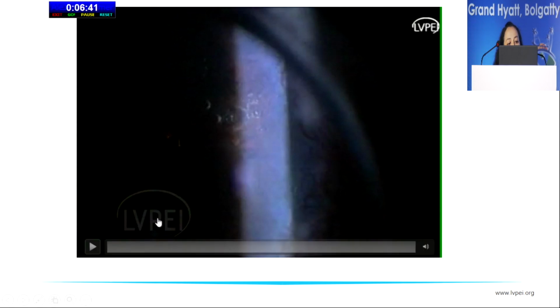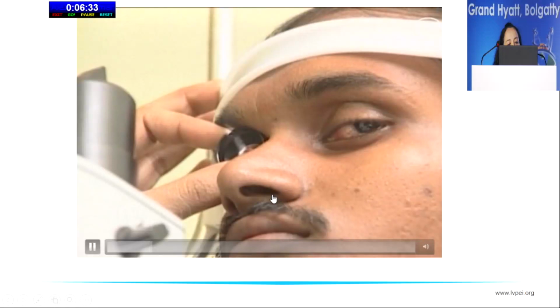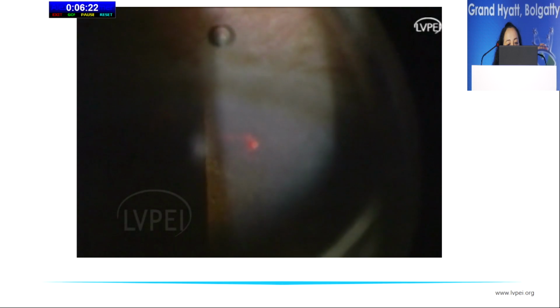In this small video, we'll just show the gush of fluid which happens. Identify a thin region in the depth of a crypt or in an area evidenced by a rather lacy, transilluminated appearance. Now, aim the laser beam onto the superior and peripheral part of the iris. Focus the 4 spots of the helium neon beam, manipulating the spots until they merge into one. The shock wave travels towards the surgeon from the point of focus.